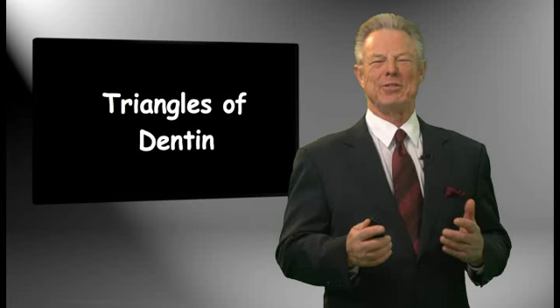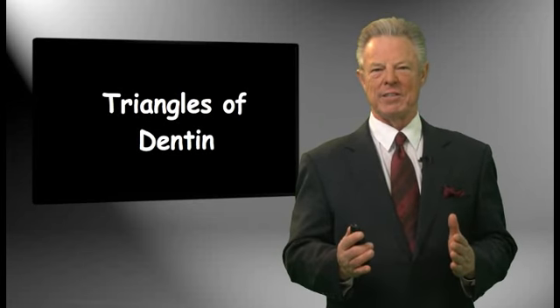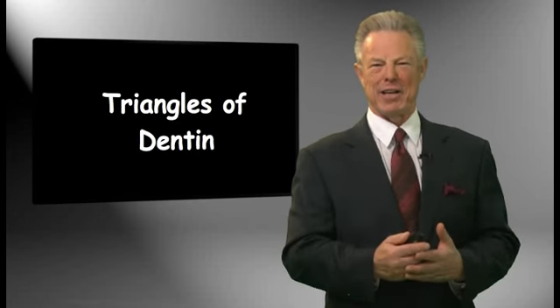The first step to successful clinical endodontics is a proper access cavity.